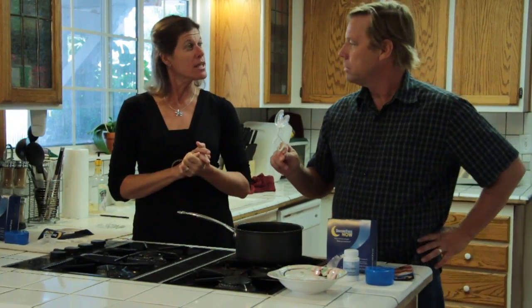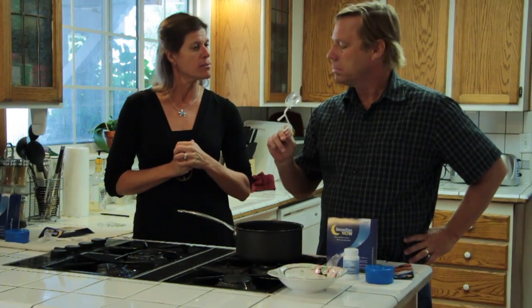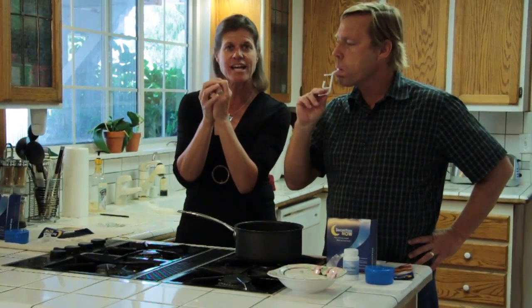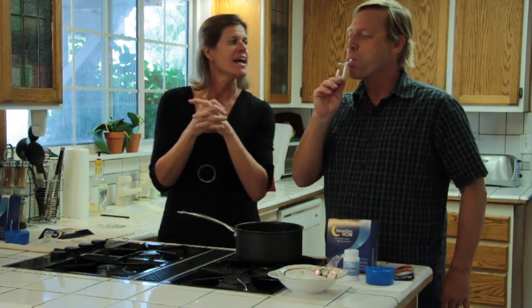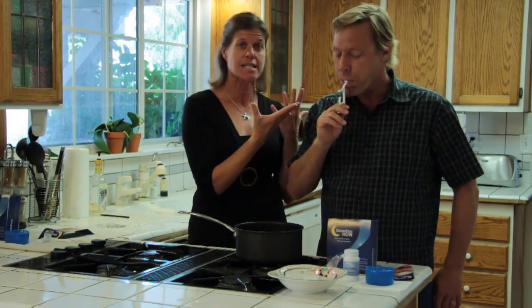Now we would actually try it out in the person's mouth. In this case, Roger's. So I'm going to put it in my mouth? Go ahead and put it in your mouth. What I want you to do is move your lower jaw forward, take your tongue and push the little flange, and then make a funky sucking sound. Nice! That's like a little fish, isn't it? So you need that little fish sound. This is getting all the extra air bubbles out, and it will make it so it fits correctly.